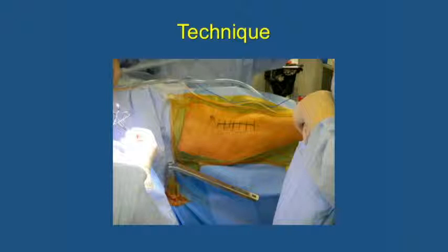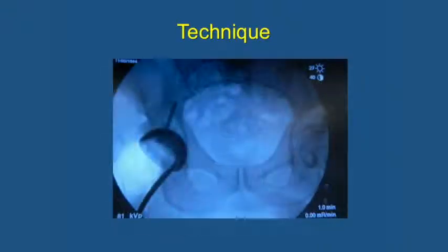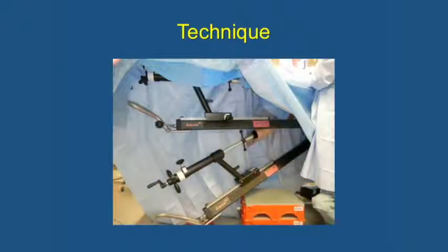But here's everything draped out. This little hook here is a special device that you need to do this surgery. It's attached to a power elevator. That device there, sterilely dressed into the field, helps us pull the femur bone up when we're trying to do your surgery. You can see here an intraoperative x-ray of this particular patient. That's the reamer that we use to clean out all the arthritis and cartilage. And that's a cup, that's the final implant position right there.